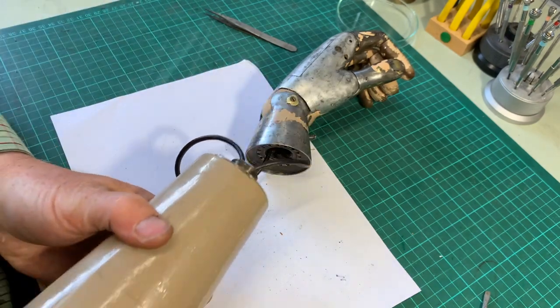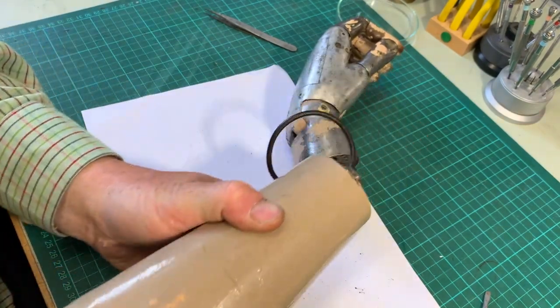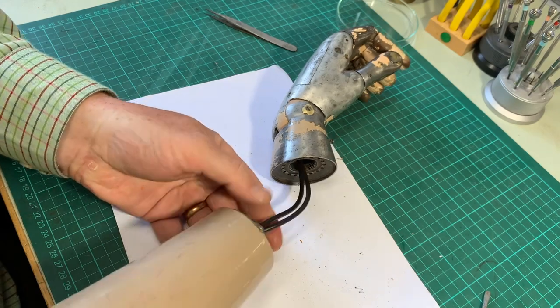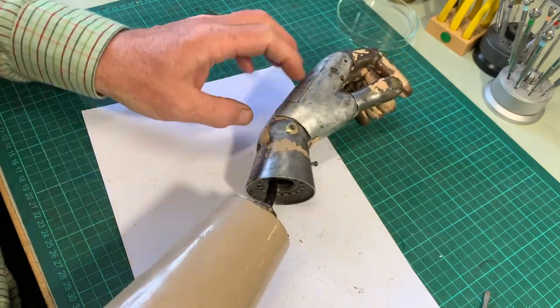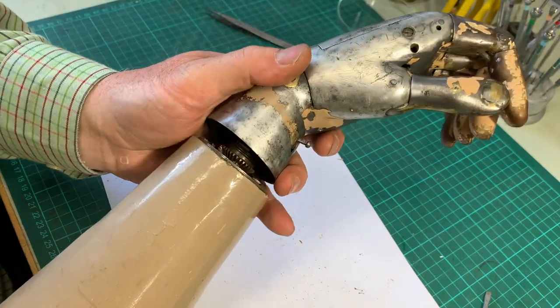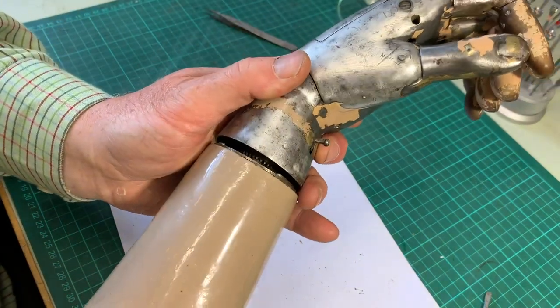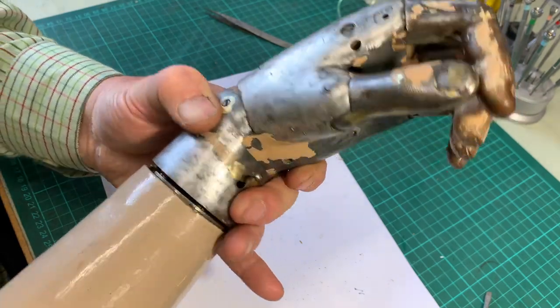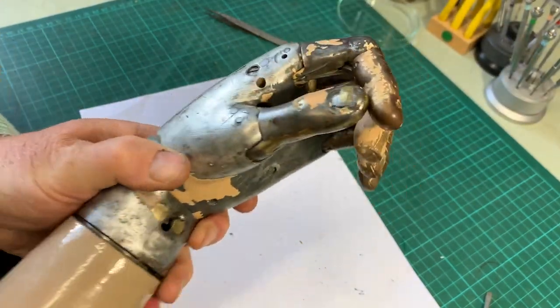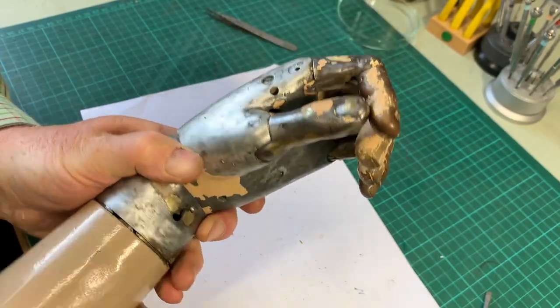The forearm is made of wood, carved and hollowed out. The wood is stopped from splitting by being covered in rawhide that's steamed and shaped and applied like a laminate — it makes it very strong. At the wrist end, a metal collar is fitted to ensure there's no splitting and to support the wrist mechanism.